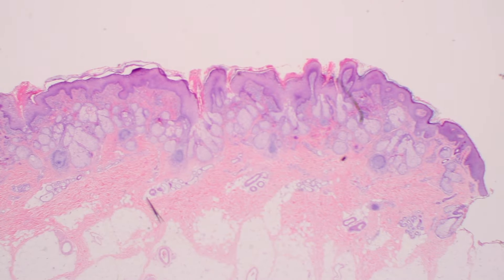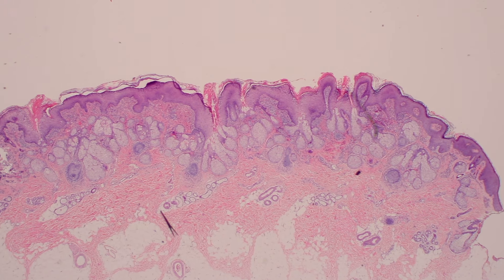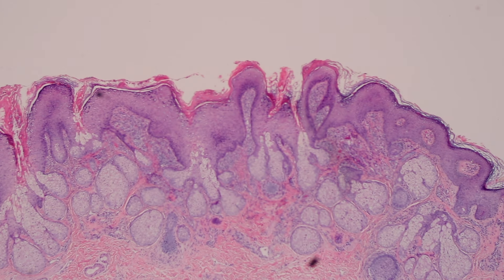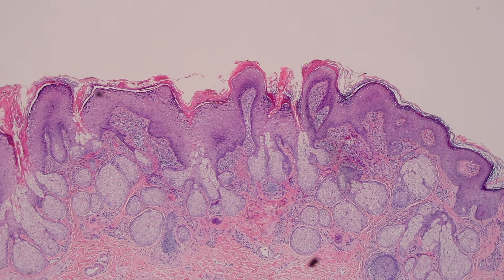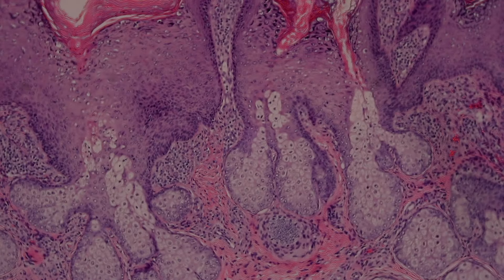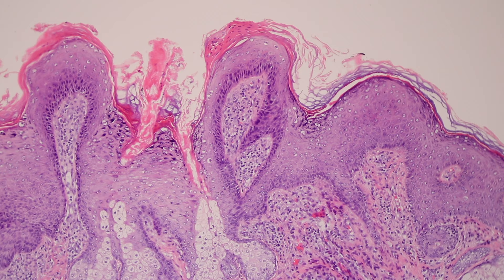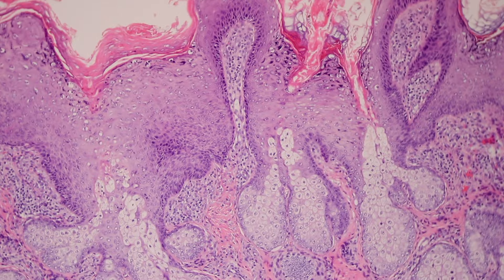Here's another example. This one has more of a warty, undulating, or papillomatous surface, and sometimes the surface really can resemble a verruca — it really can look warty. I suspect and wonder if HPV is involved sometimes in some of the surface changes in these lesions, though I don't have proof of that. No matter how long you do pathology or dermatopathology, there's always new stuff to learn.